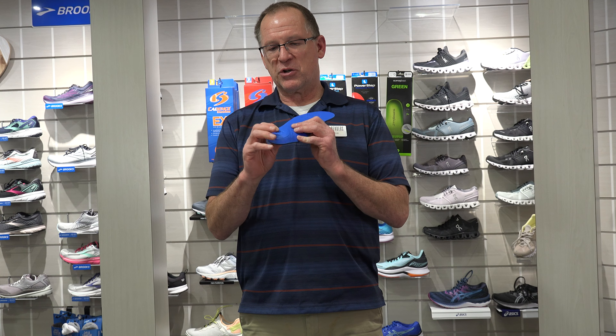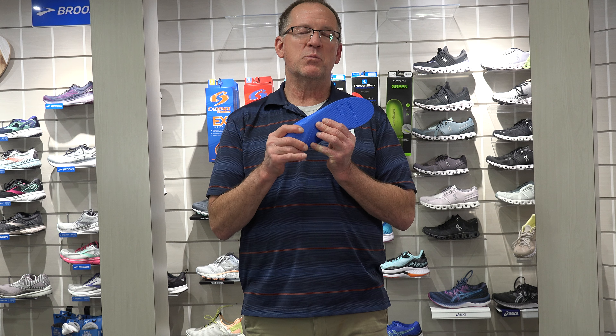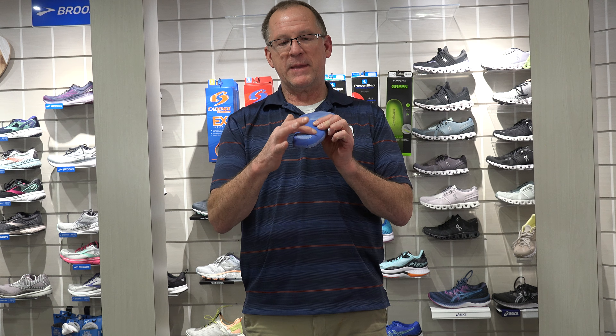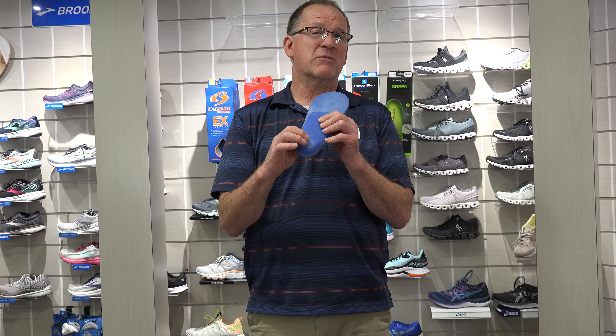The heels of some of these devices — the Power Step — have maybe a little extra cushion in the heel, but not a lot. People who are taking a lot of hard steps on concrete all day can actually bottom out on this, and the cushion will wear down. Same with the Super Feet brand. What I like about Cadence is they cut a window in the hard plastic frame, filled with the same quarter inch of silicon rubber. The heel is captured by the plastic frame and offloaded because there's a window for it to float off the ground. So when it comes to people doing five, ten, fifteen thousand steps a day, this is a very, very comfortable insole.